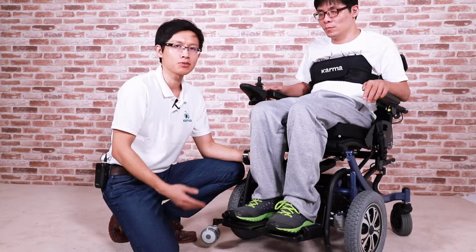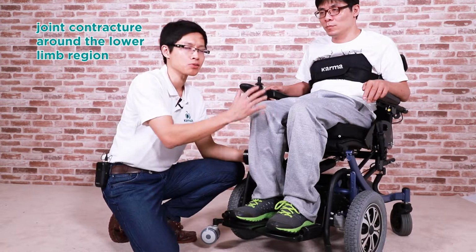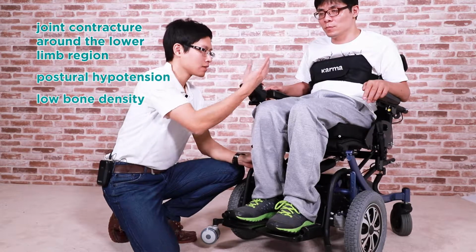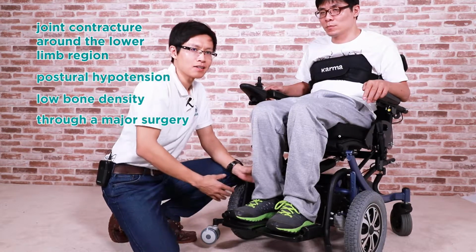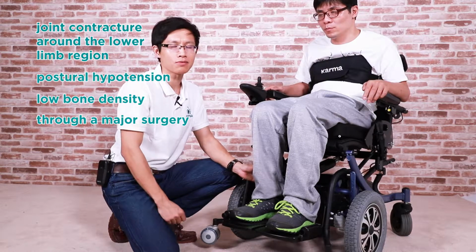Standing wheelchair is not for everyone. For example, if you have a severe joint contracture around the lower limb, postural hypotension, lower bone density, or you just went through a major surgery, then a standing wheelchair might not be your choice.